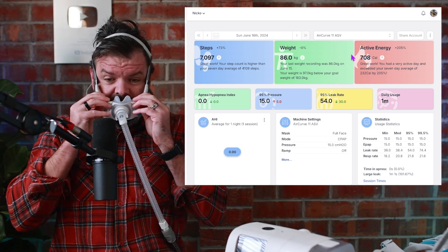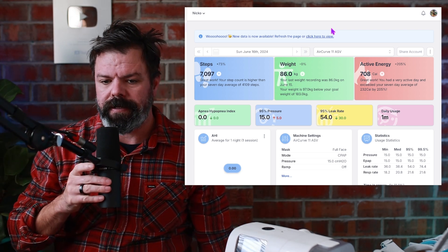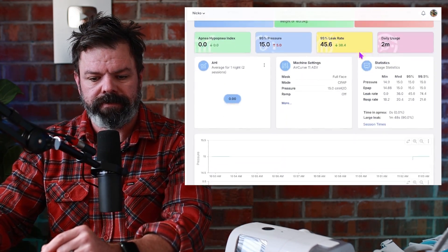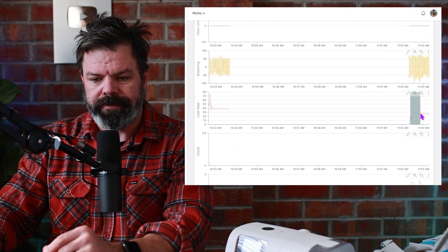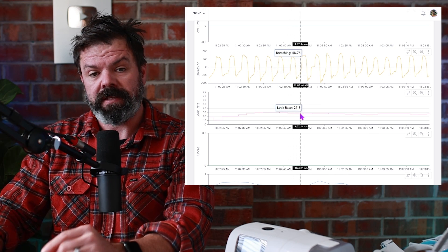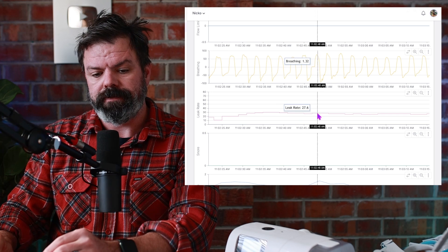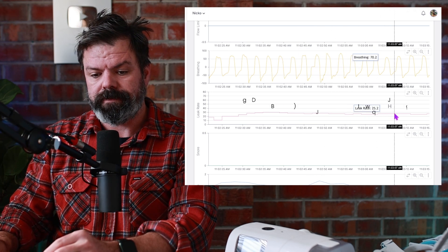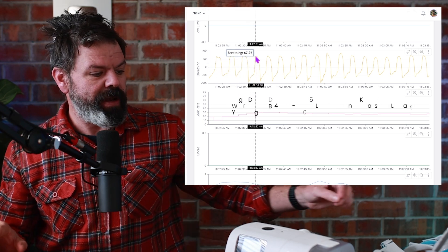Here we go. So this is the mask leak — it's 15 centimetres of pressure, quite high — around the 27 litres per minute mark. There's my breathing: breathing in, breathing out. Now let's change masks.